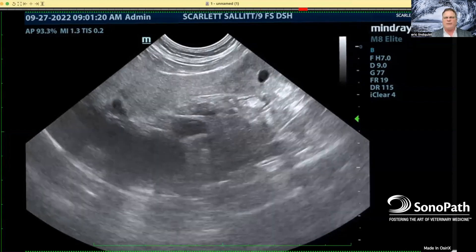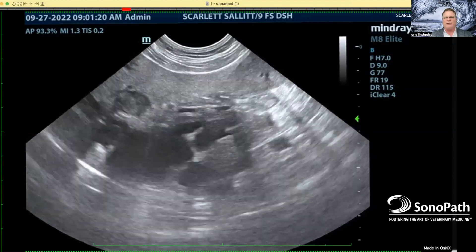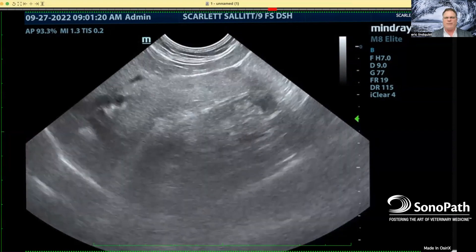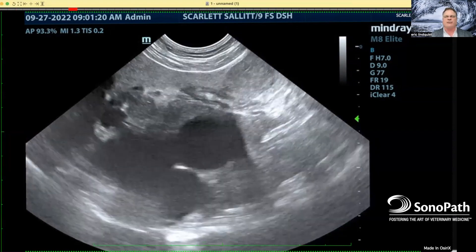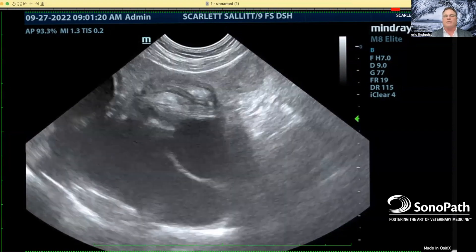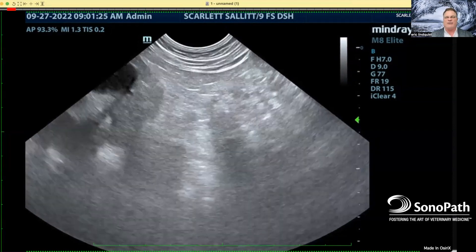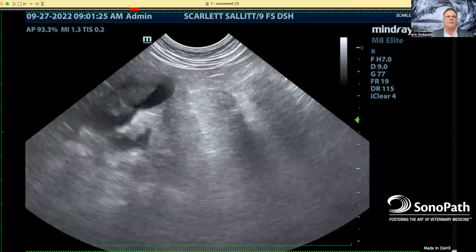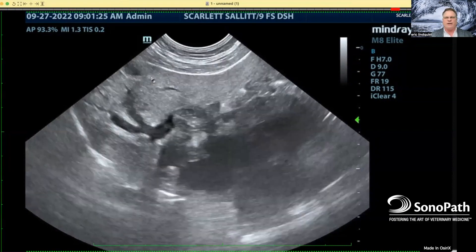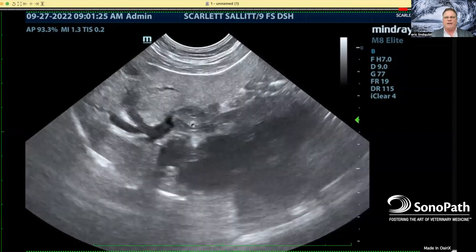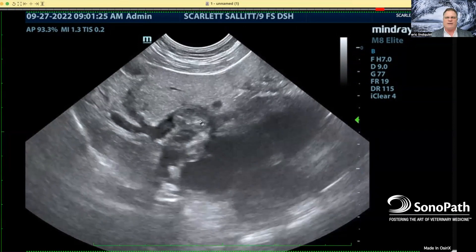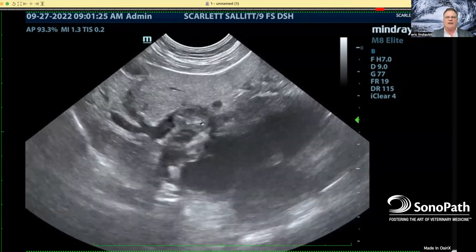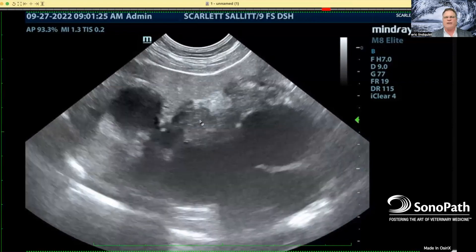So obviously too many tubes for one cat, a lot of nodules, and a lot of badness — but this is not what you want to see when you have a bilirubin elevation and alkphos elevation in a cat. You're hoping for lipidosis. Other things like this — biliary carcinoma, post-hepatic obstruction, and a bunch of extra tubes — is not a good thing. You can see another mass right here, between the cystic duct and common bile duct. So multi-centric badness in the biliary tree in this poor cat.